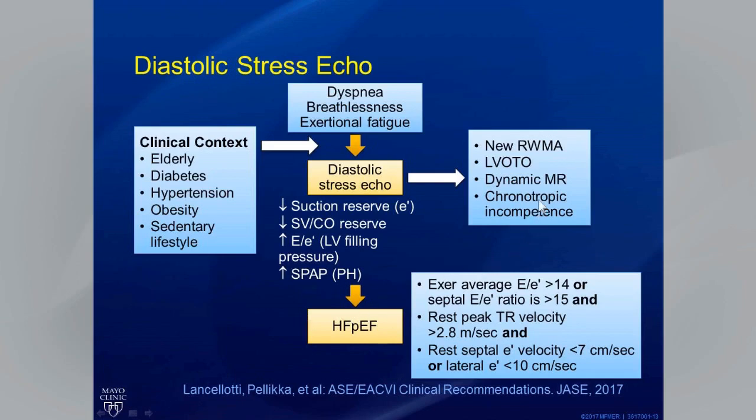We can also look for these other parameters, particularly the development of ischemia that might contribute to the symptoms, or dynamic intracavitary obstruction, dynamic mitral regurgitation, or chronotropic incompetence, which might explain the patient's symptoms.